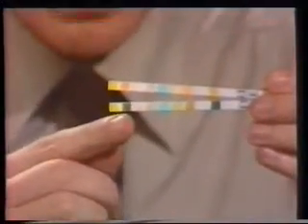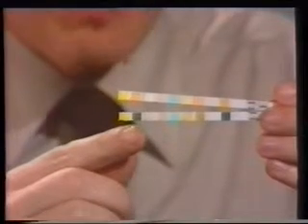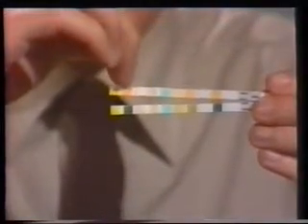And all you do simply is just to dip a dipstick into it, take it out like that. Now, this is the one that I've dipped, and I want you to look at the second pad from the end here and compare it with one that hasn't been dipped in water. Look at this second pad. It's gone deep green, registering lots of blood in that water, compared to the rather nice, modest cream colour that was there beforehand.